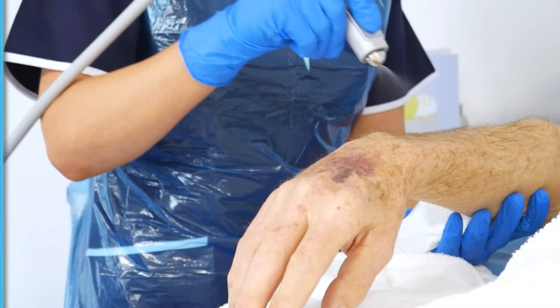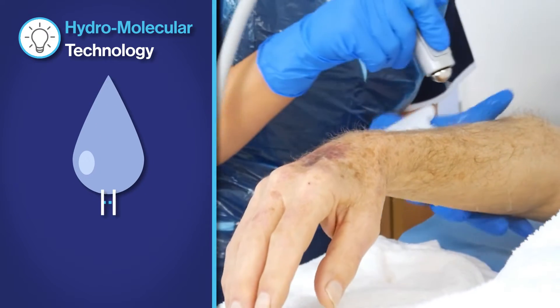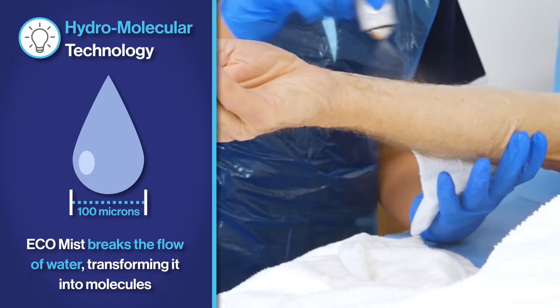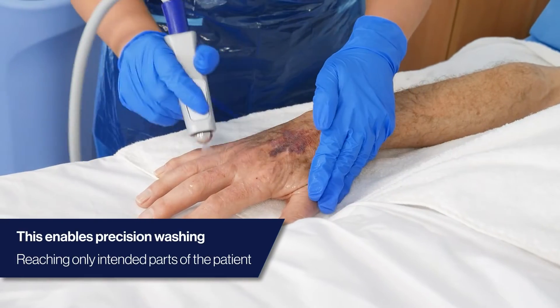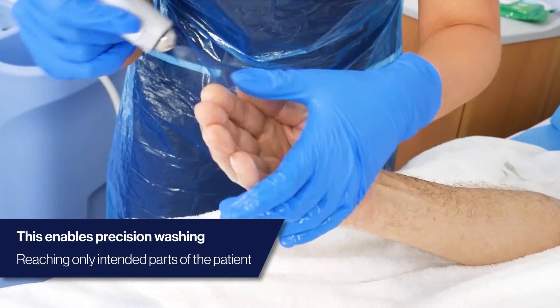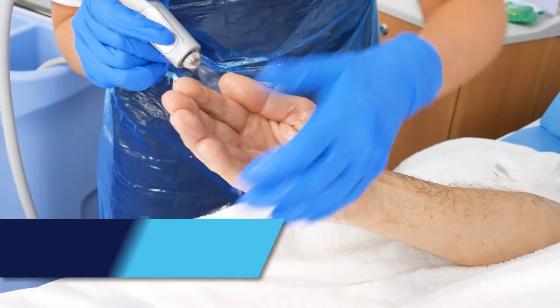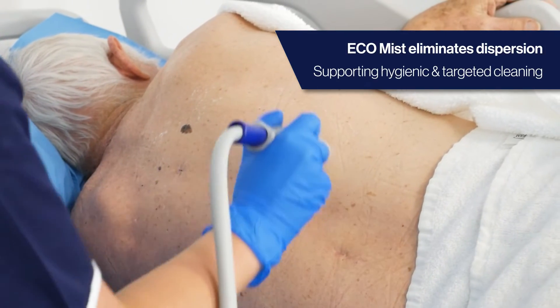The EcoMist utilises innovative hydromolecular technology to break the flow of water, transforming it into molecules and dispensing at 100 microns. This enables precision washing, reaching only the intended parts of the patient without contacting surrounding areas and eliminating dispersion of molecules in the air.